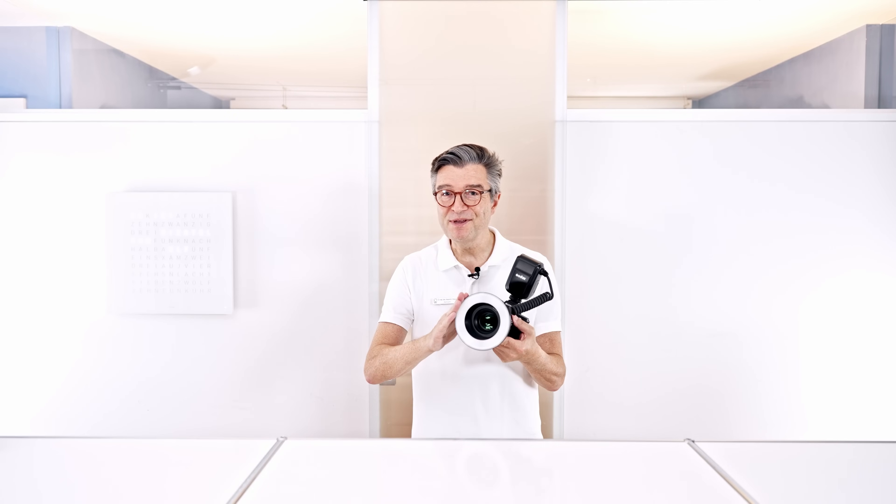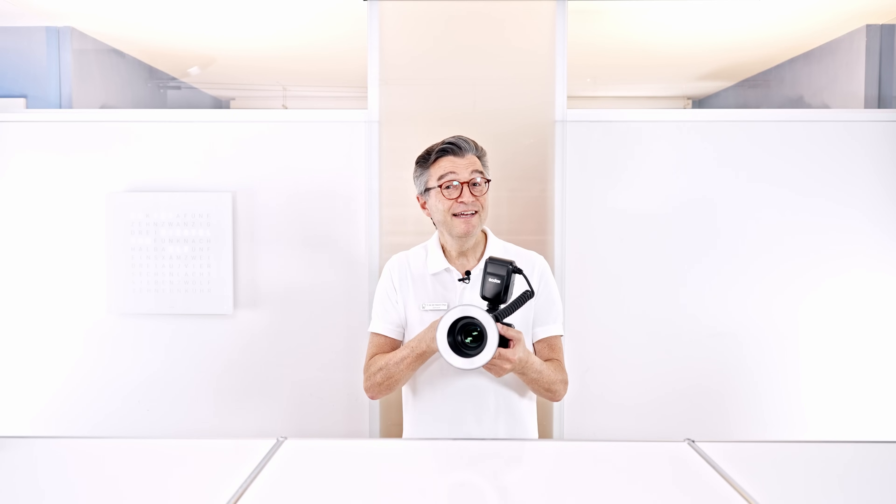Looking for alternatives, I came across the Sony Godox combination. Both offer a range of great products with high-quality, easy-to-use, built-in, long-lasting batteries. They're powerful and precise, so I can get consistent results on an everyday basis. In addition, they also offer LED lights that are great for video creation.